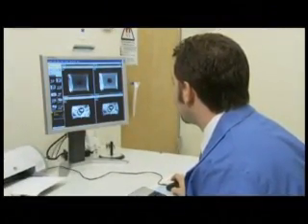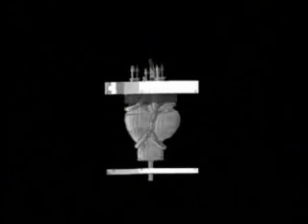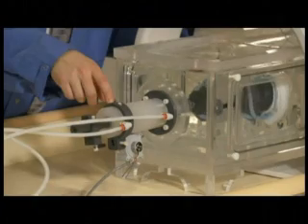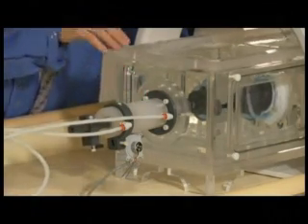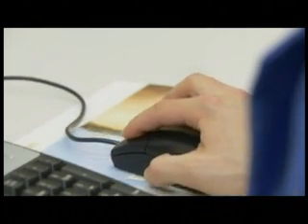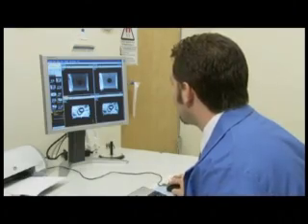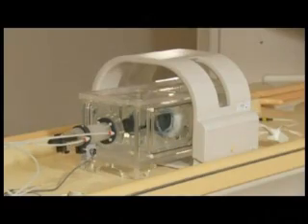This heart phantom accurately depicts the complex geometry of the human heart at a 1:1 scale. Doping the phantom's construction material with an MR contrast agent allows its relaxation and contrast properties to mimic the properties of actual human myocardium. Using MR-compatible pneumatic actuators, the phantom is able to exhibit realistic motion inside the scanner during data acquisition. The software which is used for motion control even enables the simulation of irregular heart rhythms with a non-constant R-to-R interval, which is the source of poor image quality for many existing motion compensation techniques.